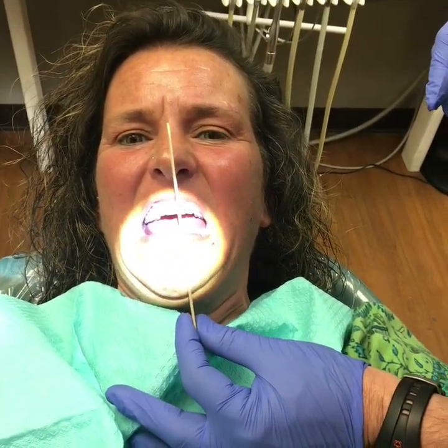Midline is on, right? You agree? All right. Bite down and close. Say 77. 77. Say 66. 66. That's okay. Not gummy. What do you think? No, they're not gummy at all. Bite down. They look pretty good. They do. Nice. They're wider than your lower teeth. You asked for that. I did ask for that.